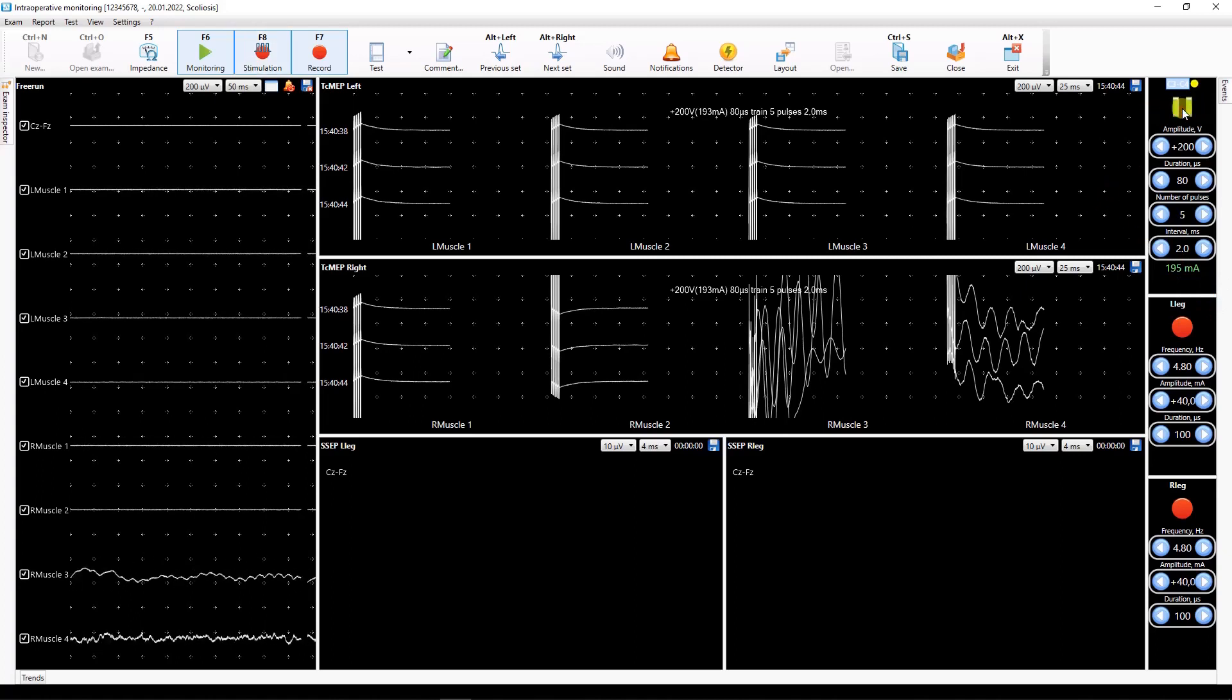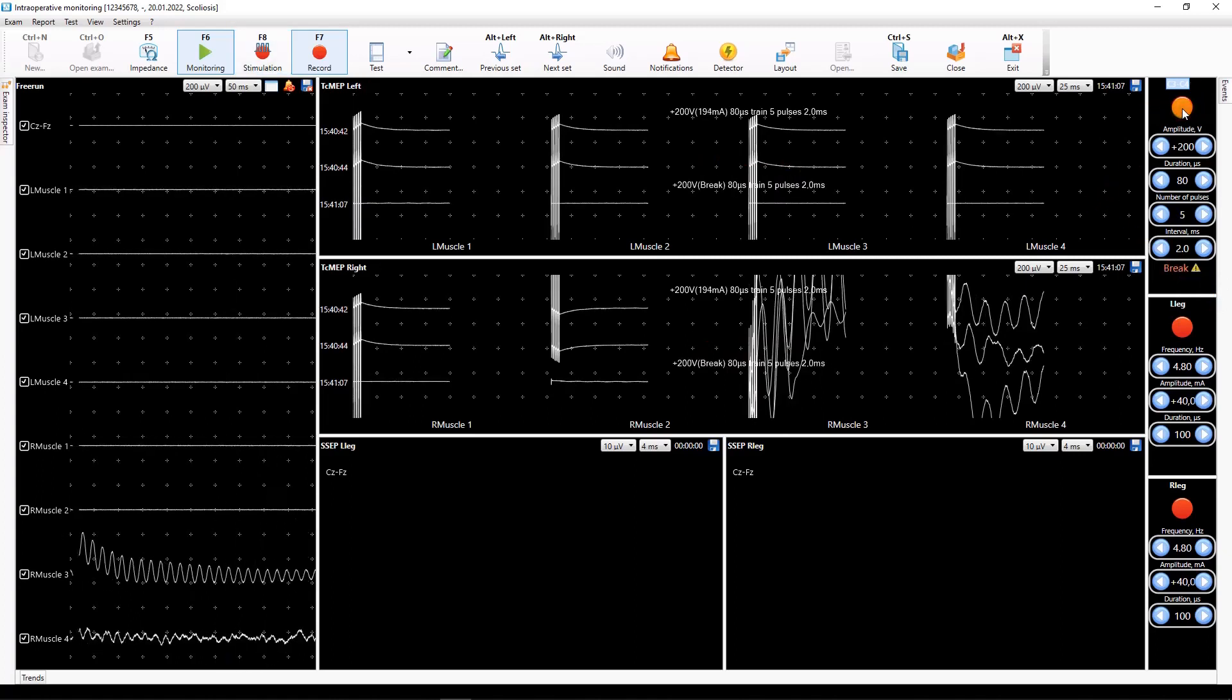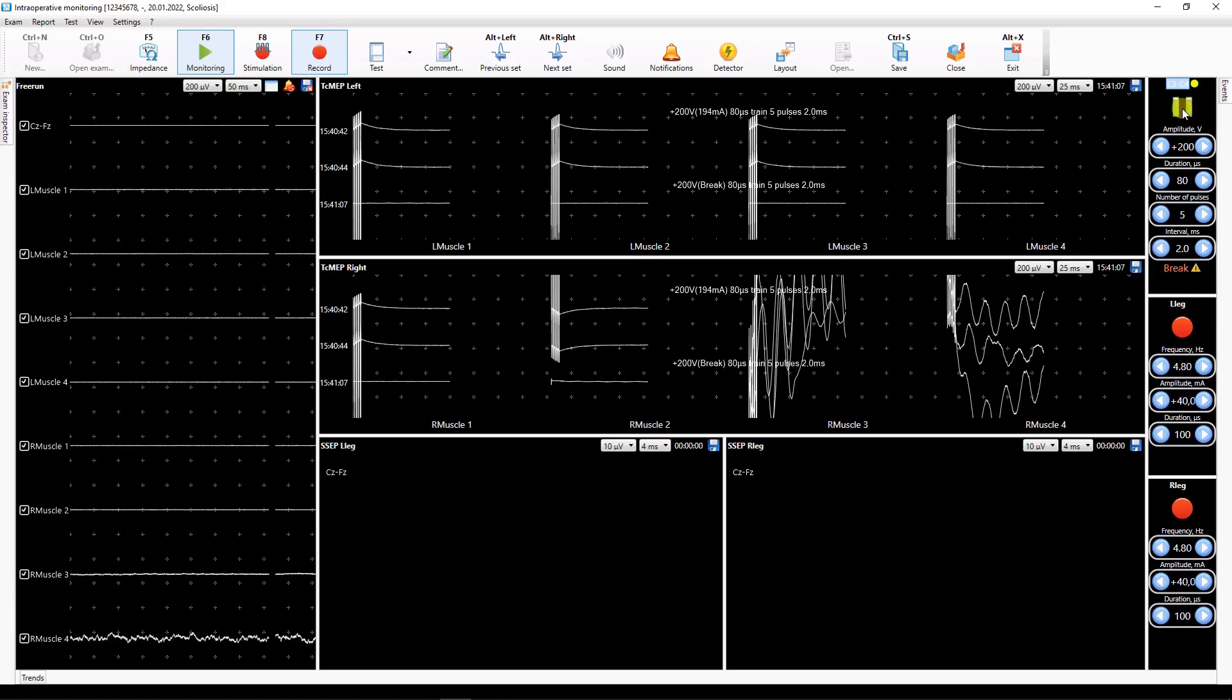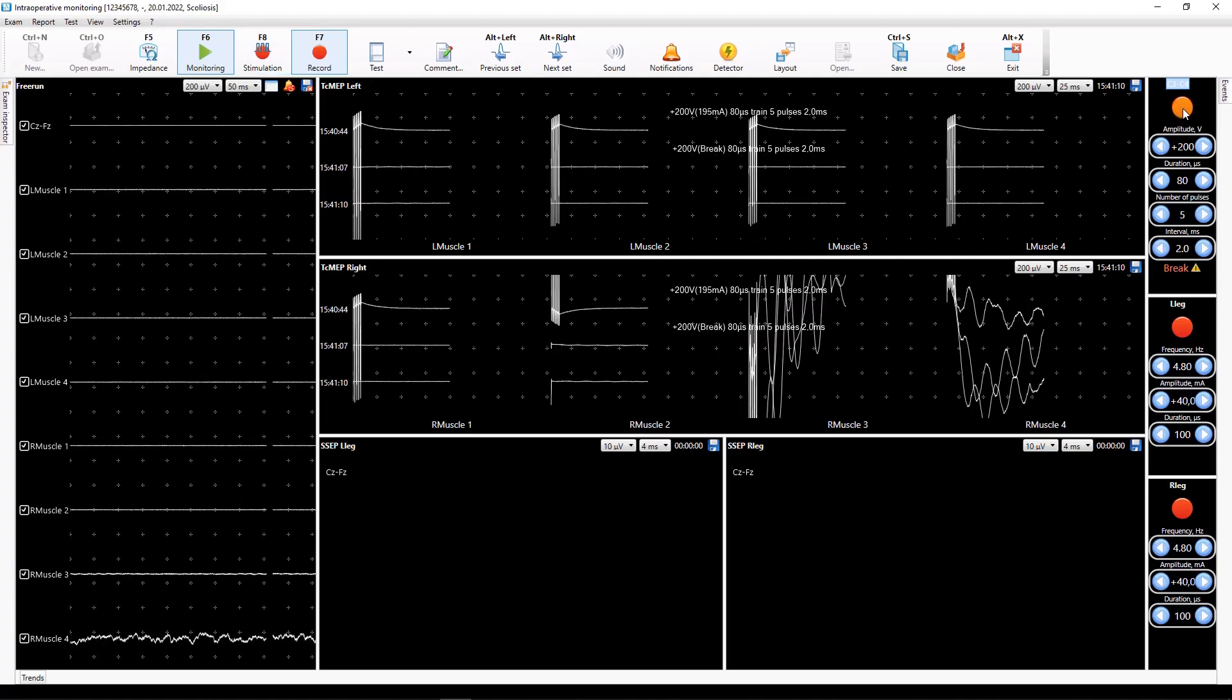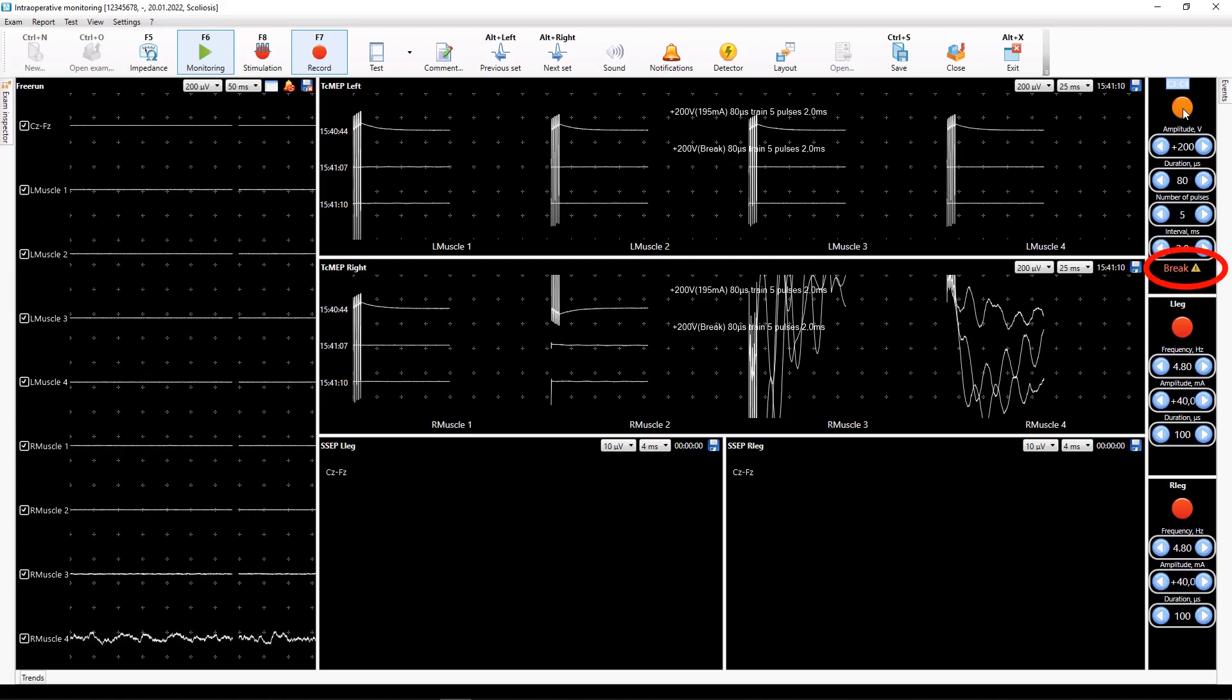If there is a break in the stimulation chain, in other words there is no contact between electrodes and the patient's body, the red inscription break will appear in the corresponding stimulator window.